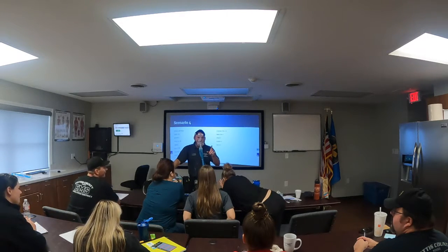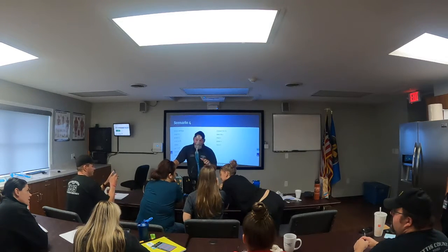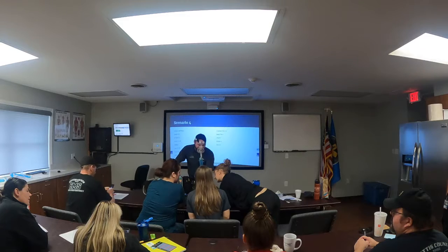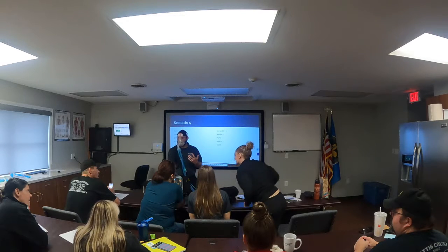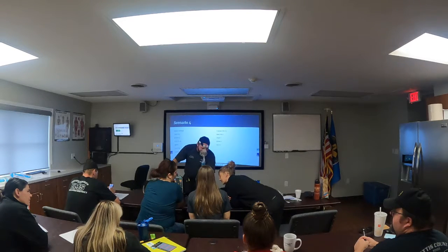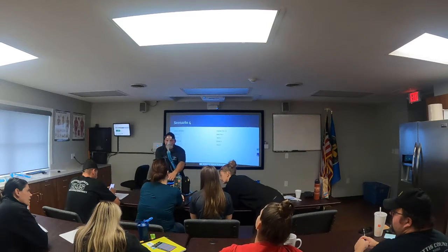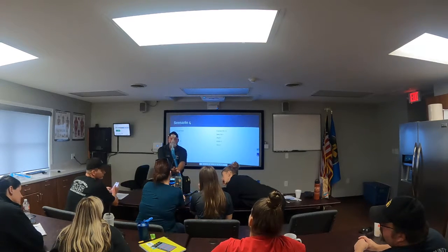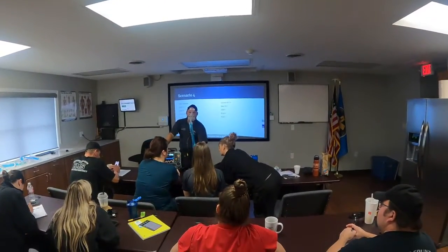Okay. I know you guys can't hear me that well, but right now we do not have the leak seal on. So we're getting a number of alarms that are not true to what's going on for our patient. In addition, we have a tidal volume of 700. Do I look like someone who's taking in a tidal volume of 700? No. The rate, we've got about 18. Not too bad. Over here, we have an end tidal of 40 and an SpO2 of 99%. Are those decent numbers? Yeah. Worry about what you see over here before we start messing too much with what's going on over here.